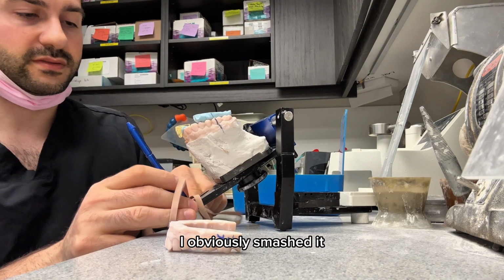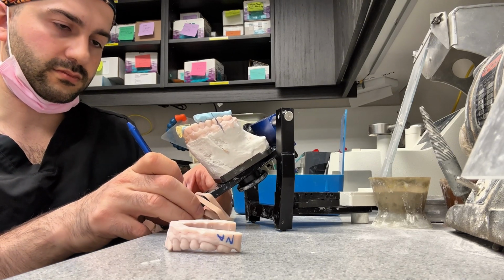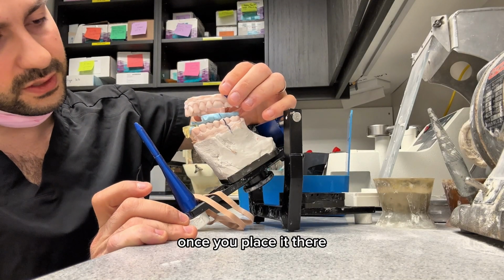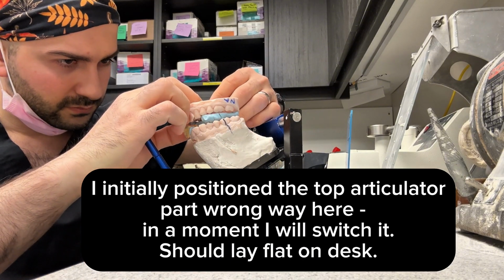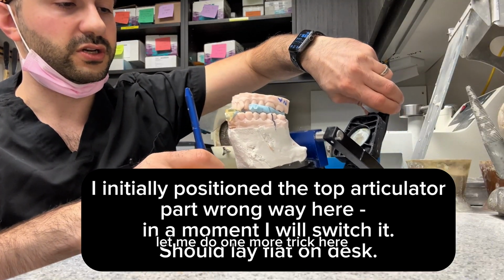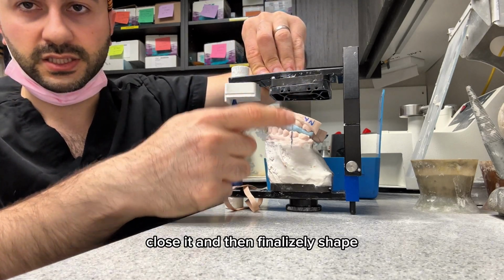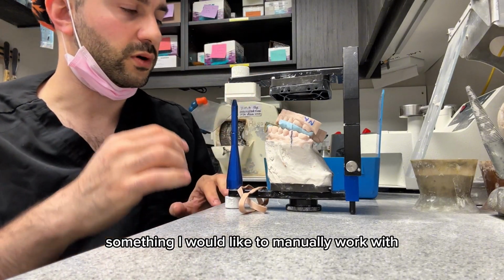Okay, I obviously smashed it. I always do that. Take another one just in case. So let me put it back. Once you place it there, you better be careful. Let me do one more trick here. There you go. I would mix the stone, put it here across, put it over here a lot, close it, and then finalize the shape. Sometimes I use a glove, wet gloves, or even my wet fingers, something I would like to manually work with.